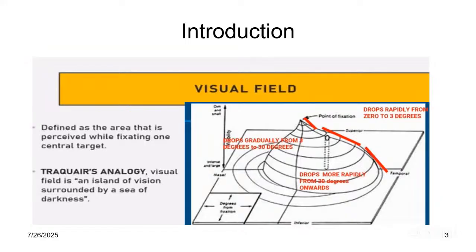So that's what is referred to as a visual field. It's actually the area that is perceived while fixating on a central target.